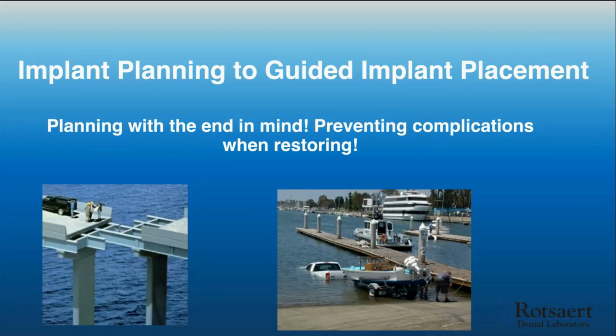everything we learn today comes with instructions for use or some sort of quick start. And the quick start only has the how to turn it on and get moving. There's always more instructions that go with these different types of things that we do on an everyday basis. And everything I'm sharing with you today is a compilation, really a smattering of a number of different companies and their guided surgeries, as well as even on the implant planning side. So bear that in mind.